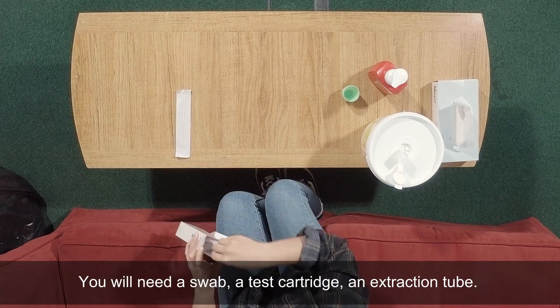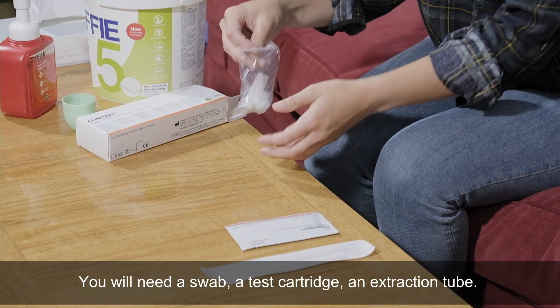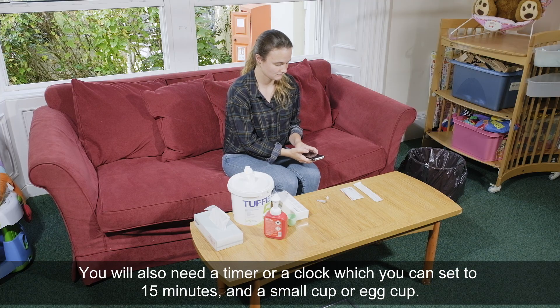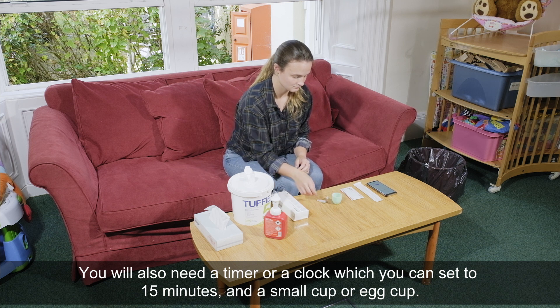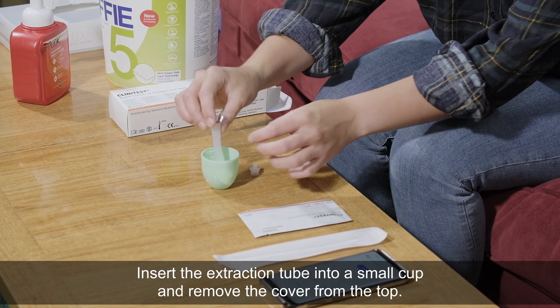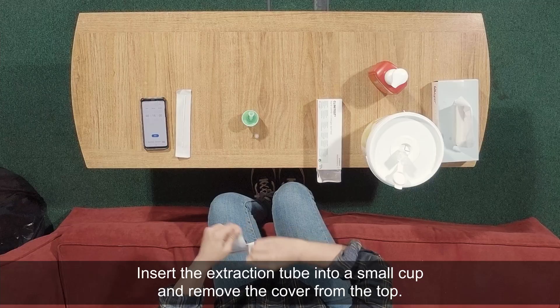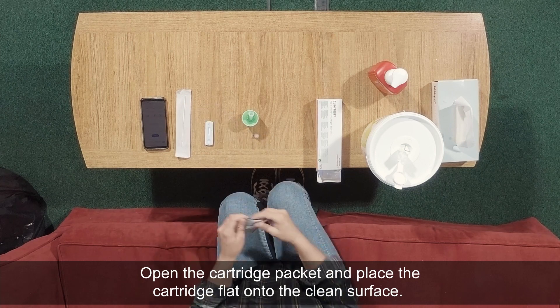You will need a swab, a test cartridge, and an extraction tube. You will also need a timer or a clock which you can set to 15 minutes, and a small cup or egg cup. Insert the extraction tube into a small cup and remove the cover from the top. Open the cartridge packet and place the cartridge flat onto the clean surface.